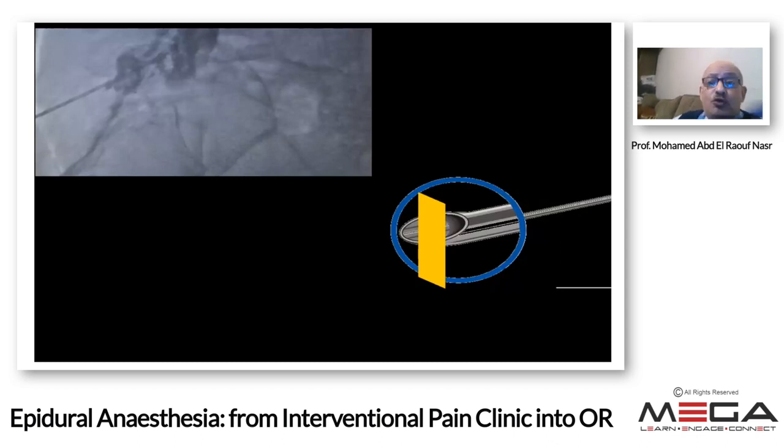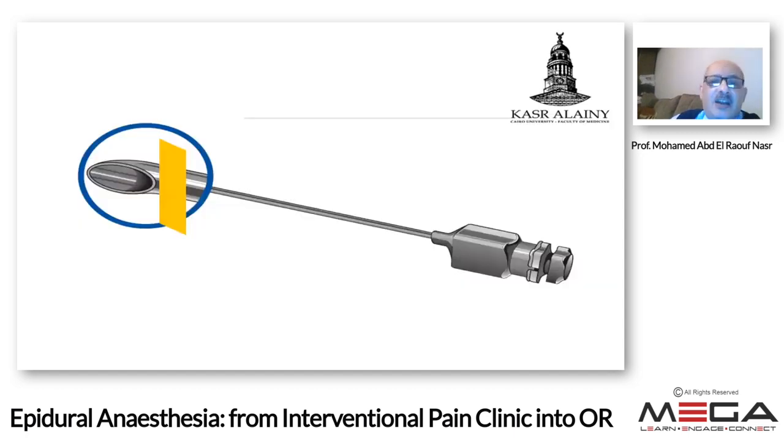But the clue to diagnose this is that you get a classic or near classic normal flow of local anesthetic in the epidural needle, but with failure of the threading of the catheter. To solve this problem, you can rotate the bevel, so all the needle is inside the epidural space. And I never recommend this.